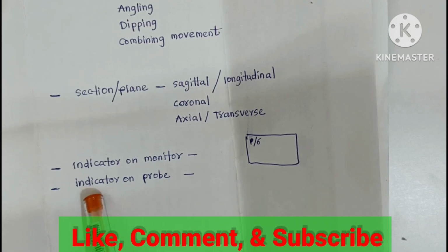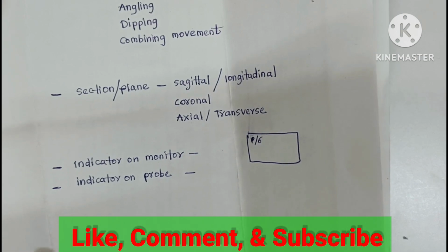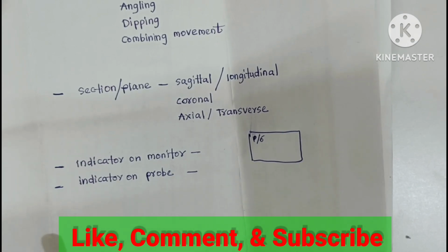Another thing we will discuss is the indicator and probe. Remember, in any type of probe, there is an indicator or marker present on the probe which helps us to take a transverse view or longitudinal view. What is the meaning of indicator or marker? It may be a company logo, a company name, an elevation, a depression, or a light. This type of marker or indicator is present in every probe.